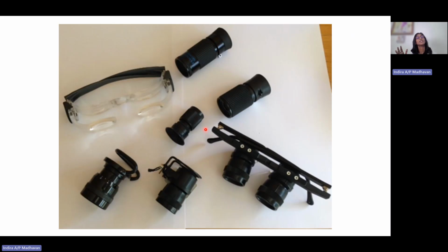When comparing to spectacles, definitely there are a lot of drawbacks with the telescope, but what we have to remember is, for someone who can't see things, if they're able to see the image of an object, even though it's in a smaller field of view, even though it's bigger, it appears closer, that makes them get some information about what they're looking at, so they would appreciate this.